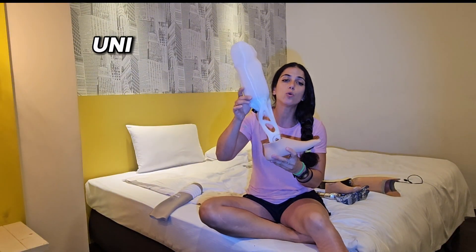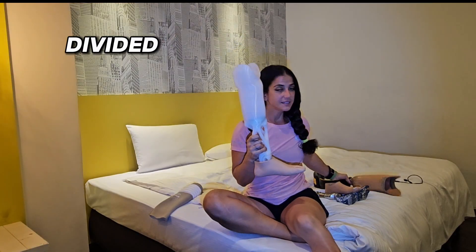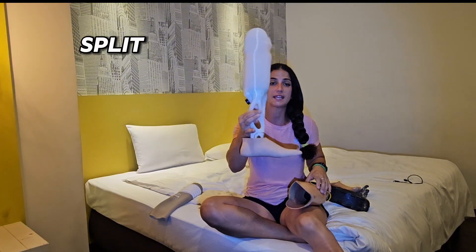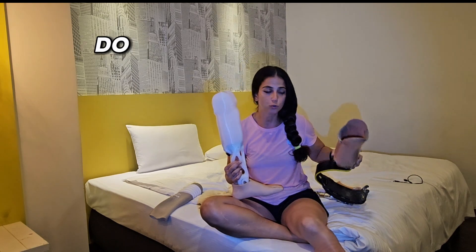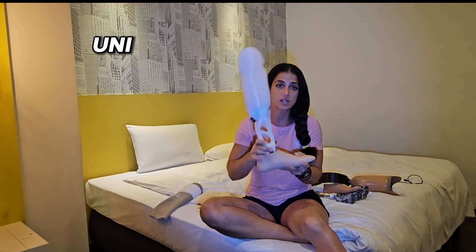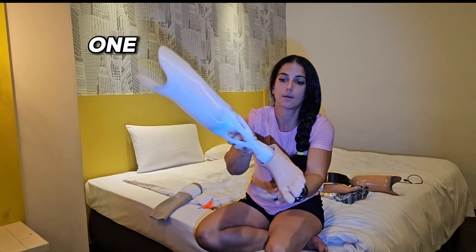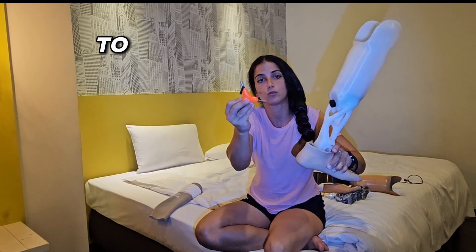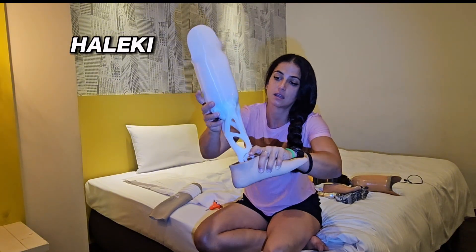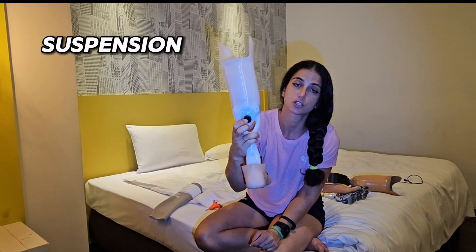Now let's talk about this leg — this is a uni leg. It looks very different. I cannot divide or split this leg into two parts like I did with the other one. That's why it's called a uni leg — it's only one piece. There is no metal at all, so I don't need to use this hex key. It still has suspension with a valve for me.